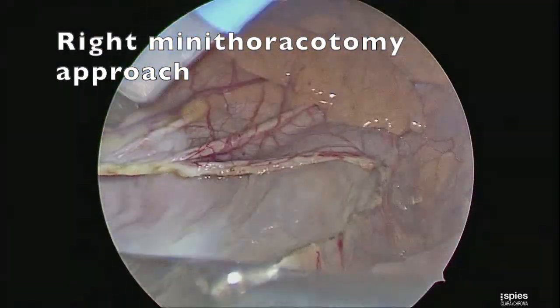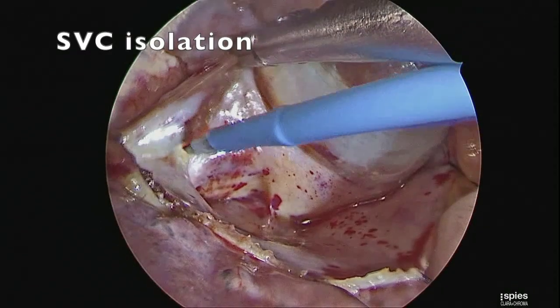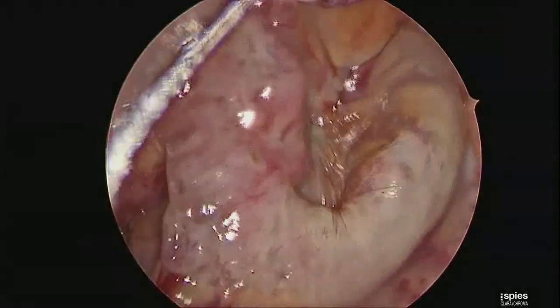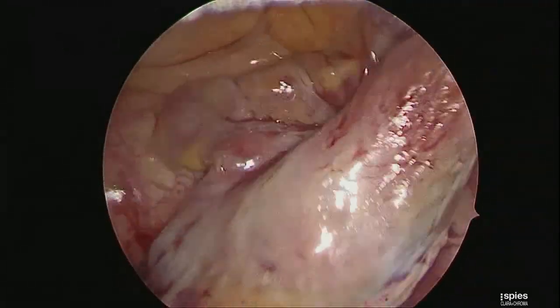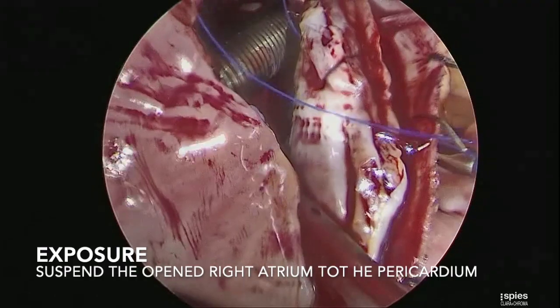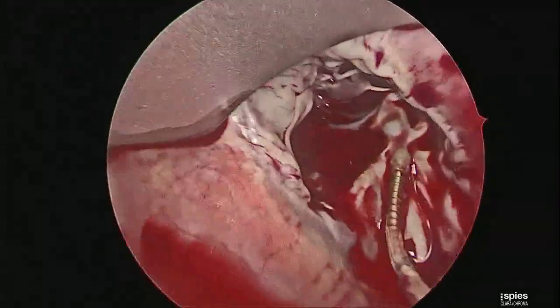The pericardium was opened at the time of surgery and caval control was obtained using caval tapes. First, the SVC was secured and then the inferior vena cava was secured. The atriotomy was created in the standard fashion and the atrium was secured to the edges of the pericardium with pericardial stitches.